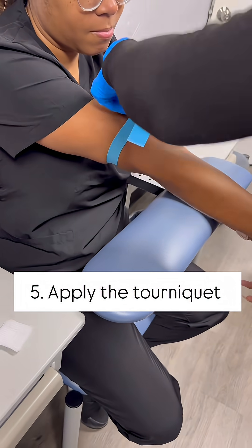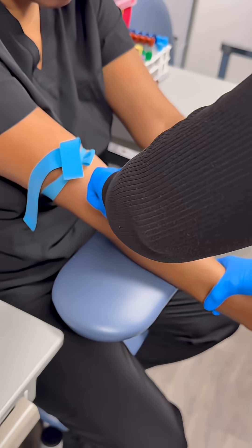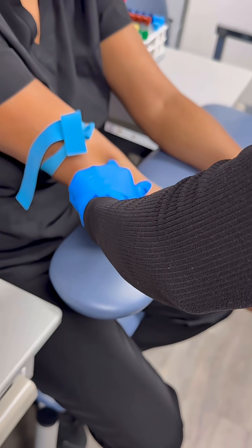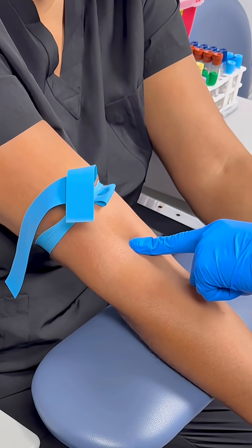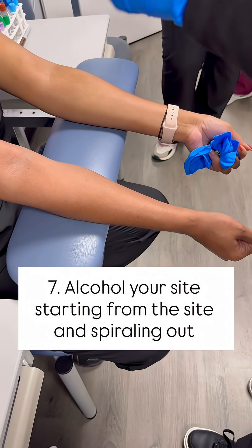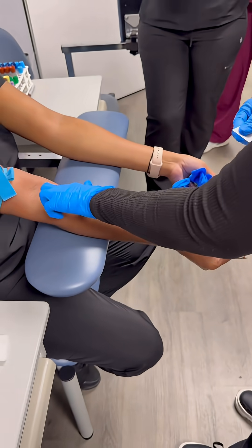Do tourniquet — cross over, under, bam — then we'll palpate across. I feel the vein there. That's the vein I'm going to go to.